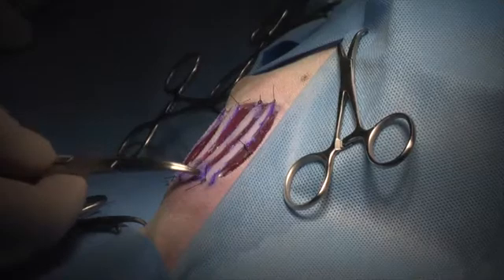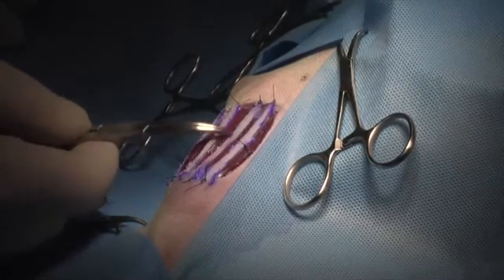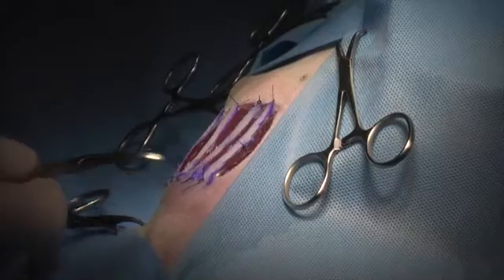So we have our first graft placed. We'll go ahead and repeat that procedure on the other grafts to get them placed in their areas. We've now completed our strip grafting technique. We see our strip grafts in the grooves, anchored at either end with one suture at either end of the grafts. The grafts are down in the grooves and we're ready to bandage this. But before we bandage, we want to go back and close our donor area.